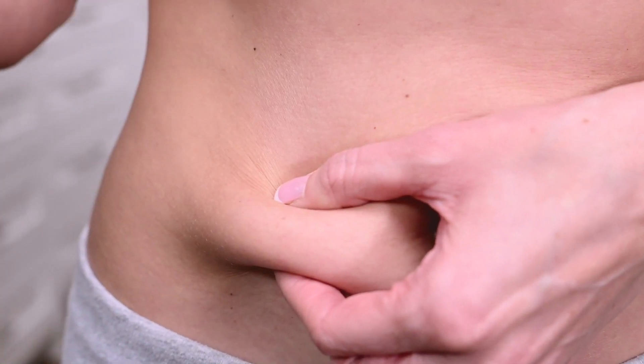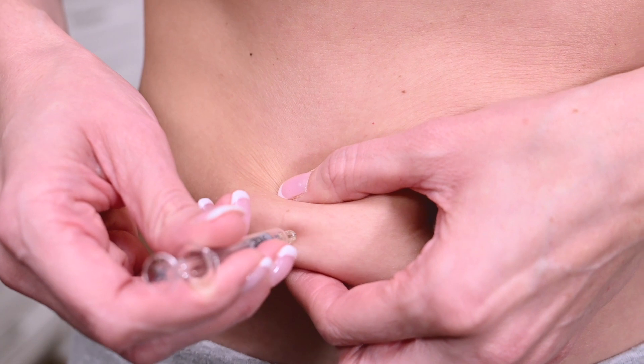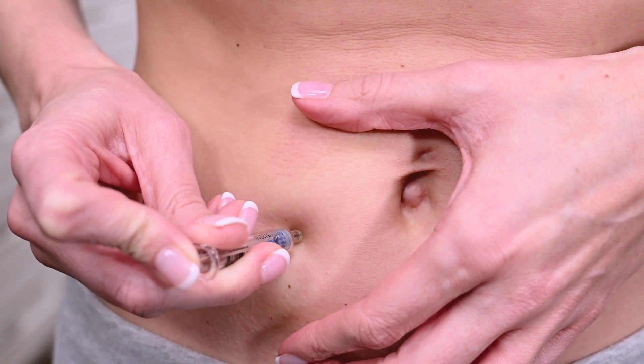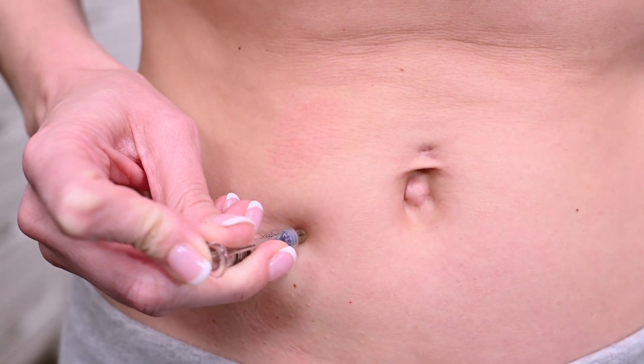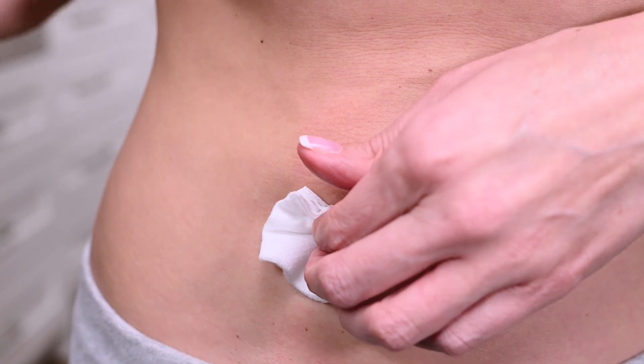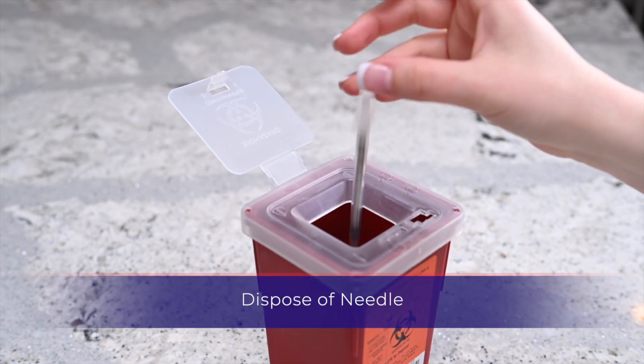Hold the syringe in your preferred hand. Pinch a fold of skin between your fingers and insert the needle at a slight angle. Release the skin after the full length of the needle is inserted. Push the plunger until all the medication is administered into the injection site. Gently remove the syringe and apply pressure with gauze. Dispose of the used syringe into the designated sharps container.